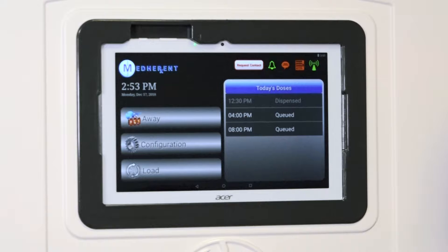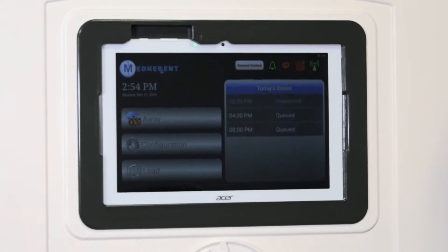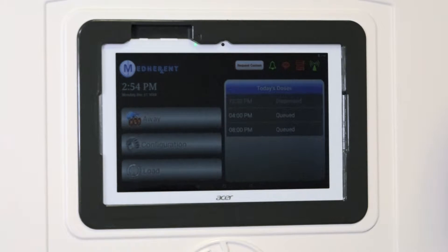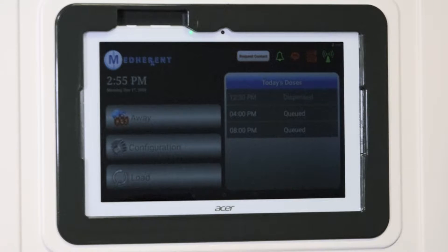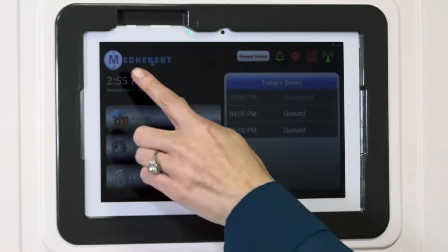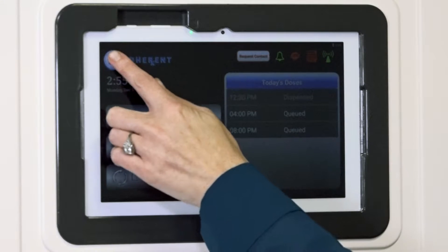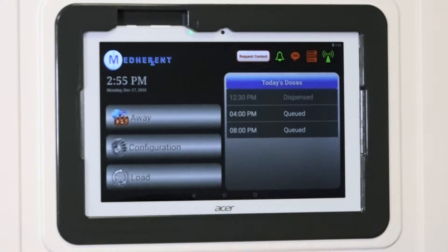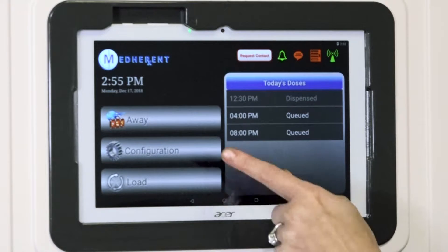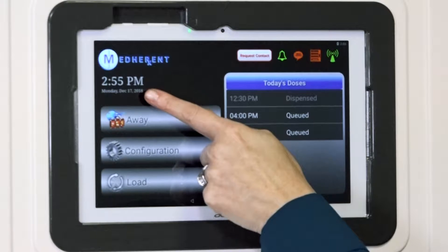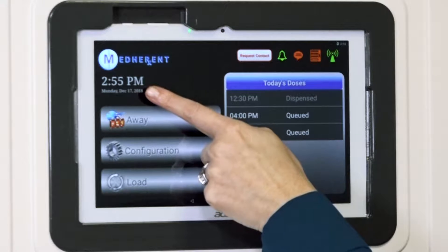In order to save power, the screen will dim a bit when it is not being used and will not recognize any commands you give it. When this happens, just tap here to brighten the screen and wake it up. The time and date are listed here.